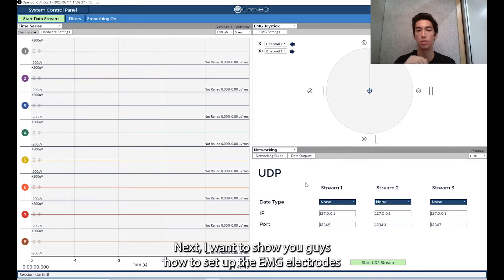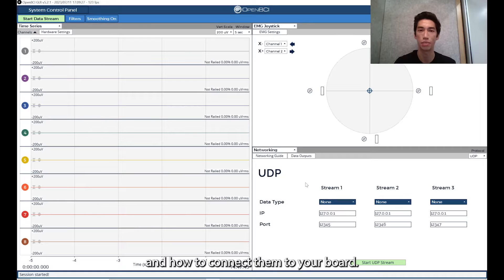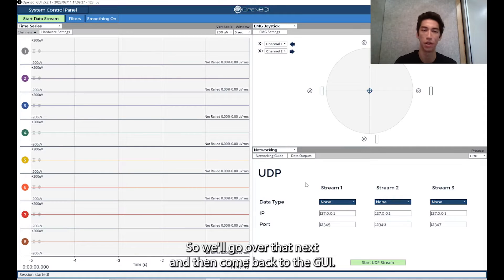Next, I want to show you how to set up the EMG electrodes and how to connect them to your board. So we'll go over that next and then come back to the GUI.